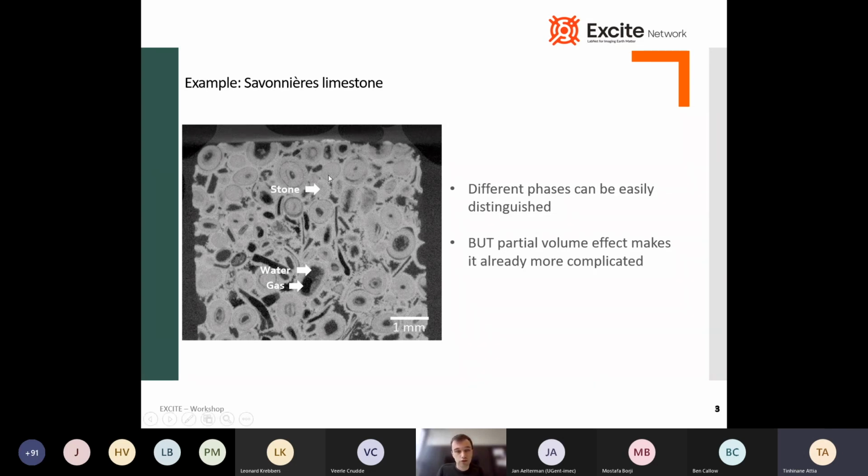You can see here the stone, which has the brightest or the highest gray values as it absorbs most X-rays. You can see in dark here and here a gas phase, which almost absorbs no X-rays. So that's why it's very dark. And in between, you can see the water phase. So in this sample, it's quite straightforward.